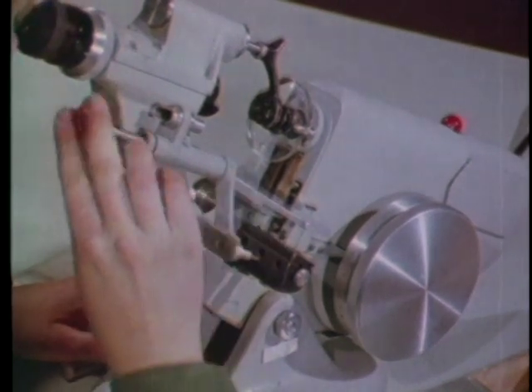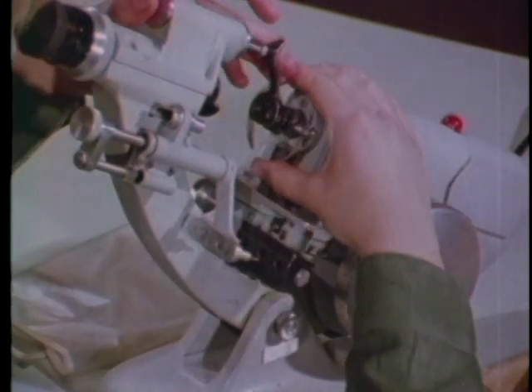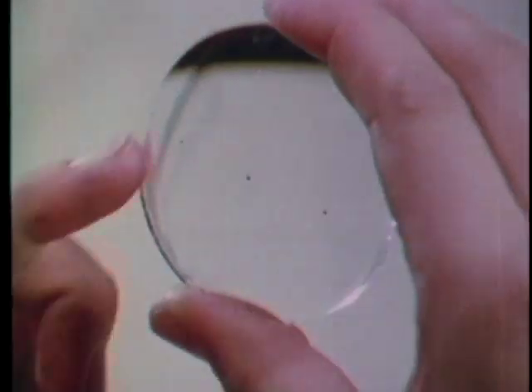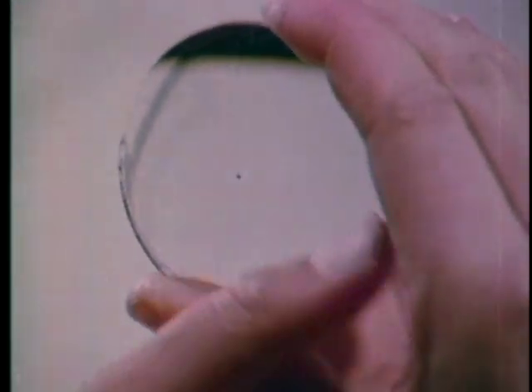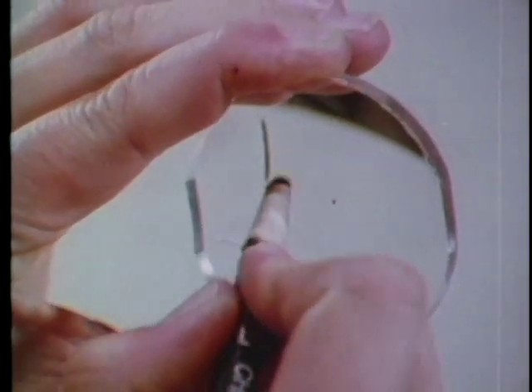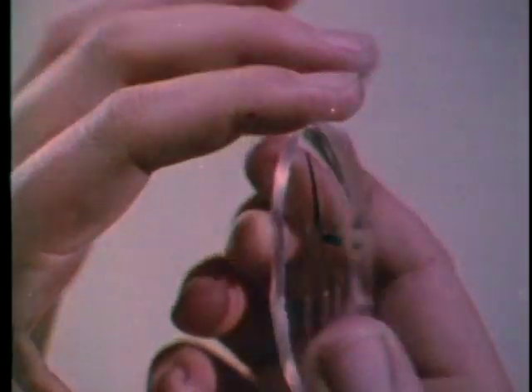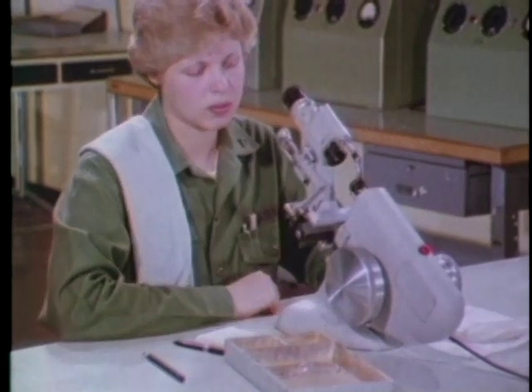Center the lens so the lines cross through the middle of the reticle. Mark the optical center of the lens. Wipe off the two outside dots and mark the lens. This completes the procedure for neutralizing a spherical lens.